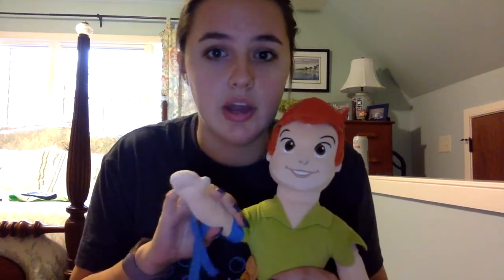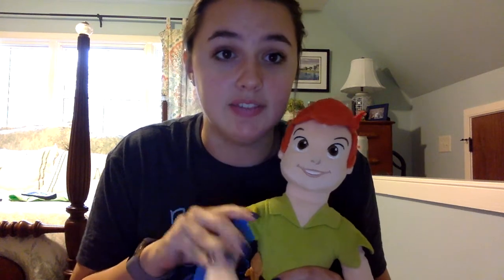So if the nurses or the doctor put some fluids into one of your veins here, then those fluids are going to go to the rest of your body as well. So this is Peter, and Peter's going to help us learn about IVs today. So Peter's going to get an IV also, and while Peter's getting his IV, I'm going to show you what an IV looks like so you can maybe feel more prepared.